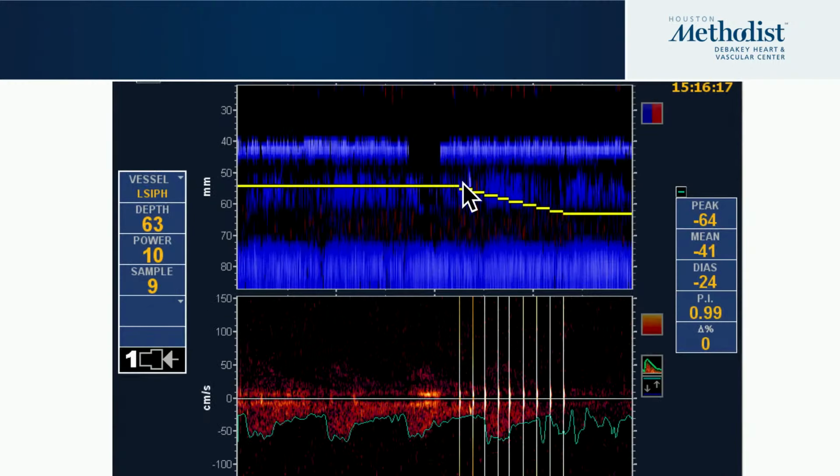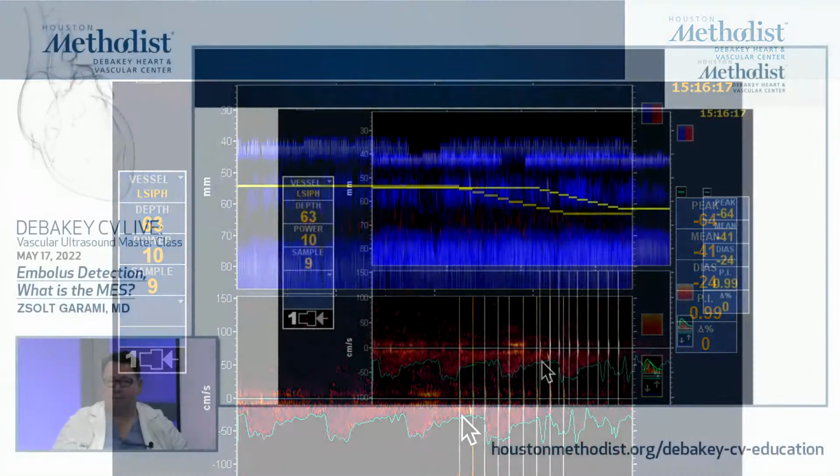Here we're changing the depth, and while you're changing the depth, an embolus sneaks in. So the embolus is between while you're changing the depth. This is the embolus. You need maybe a microscope to look at it, but this M mode helps you to really see it, coming right there. And I think you're nicely seeing it with this changing depth.